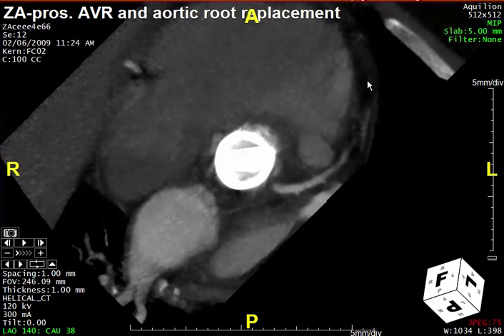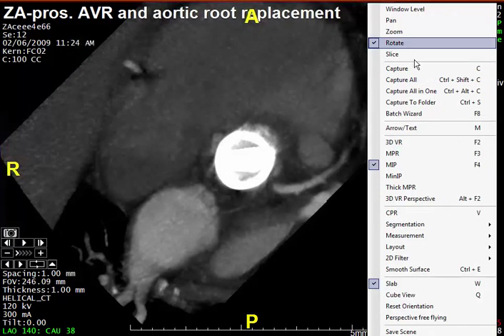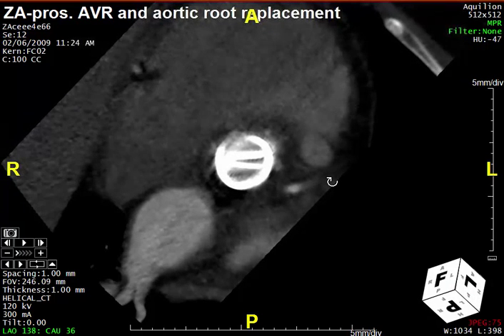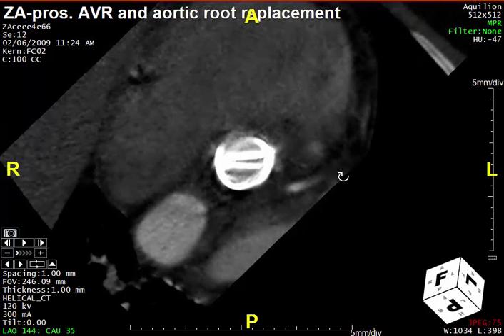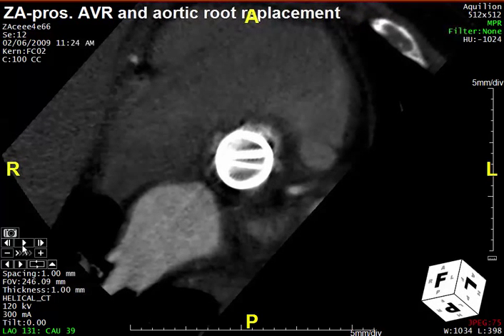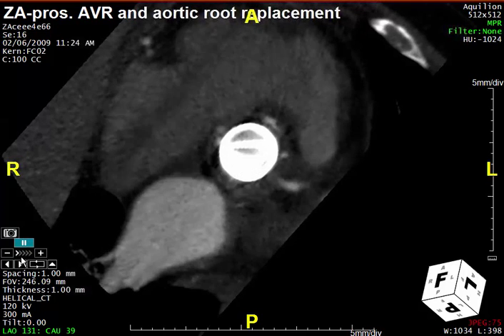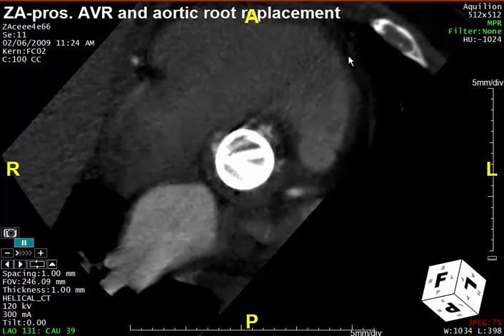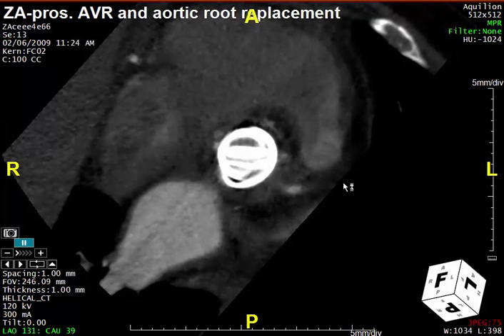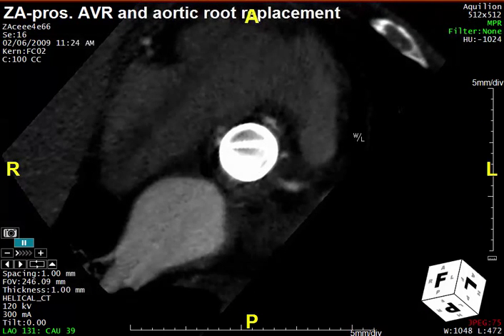This is a cross-sectional view through the bi-leaflet aortic valve mechanical prosthesis. We'll make this a bit thinner here — you can see the leaflets very nicely. I'm going to adjust the window and level just a little bit to try to make things look a bit more realistic. You can see in the cine motion that you can appreciate the motion of the valves as they go.